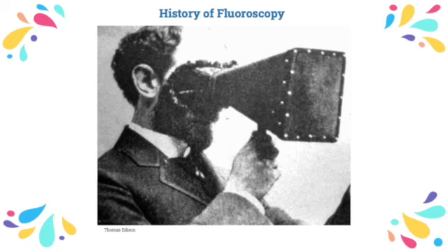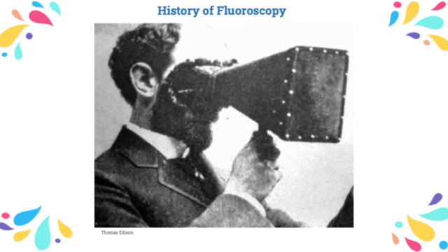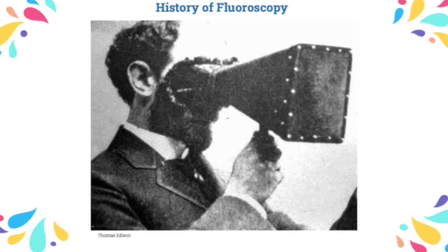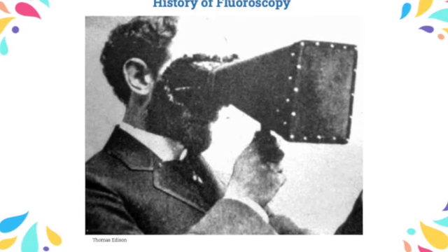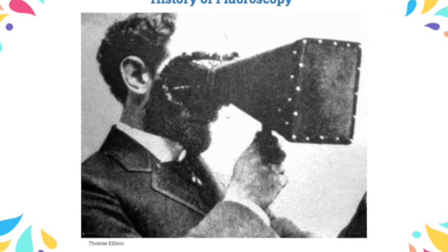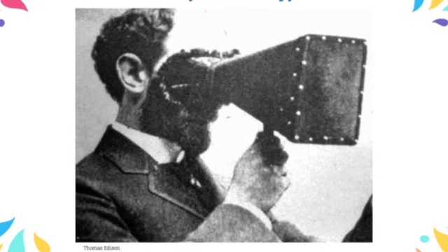So this is a little bit about the history of fluoroscopy. Thomas Edison invented fluoroscopy in 1896. The original composition was made of a phosphor screen with a lead backing. The design of this was not optimal because it resulted in low light images, and the images were viewed directly by the radiologist, and when you were viewing the images, they were viewed in complete darkness. The main problem is that it caused decreased spatial resolution and it increased patient exposure.